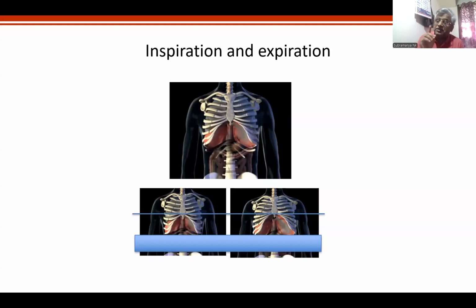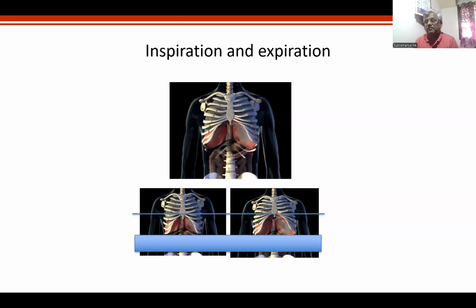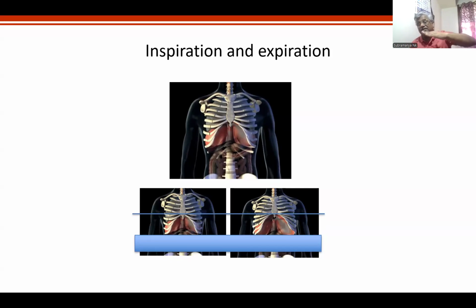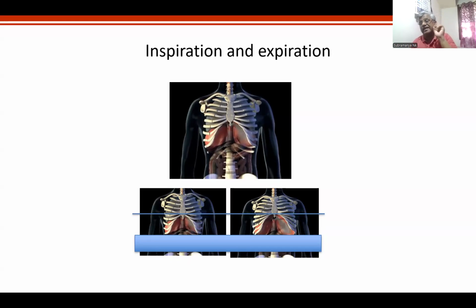Now you have to type yes if you really agree. Now I have given you the logical indications for lateral X-ray. Please don't say I want an X-ray lateral. If you think that you take the upper half and the lower half is the point of evaluation, take a lateral X-ray. Here you don't have to go to CT scan.